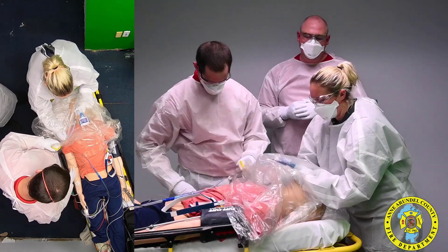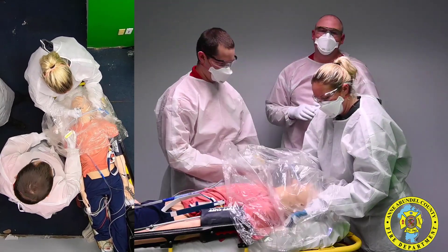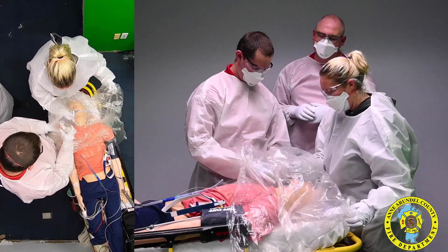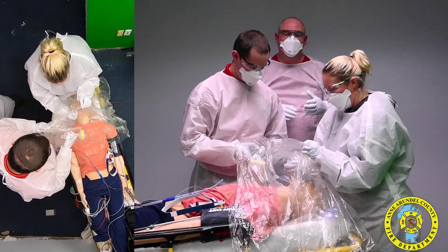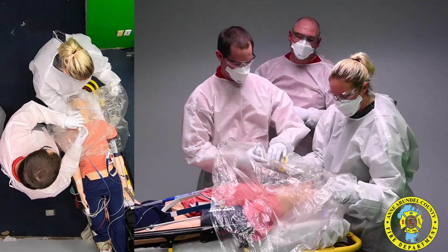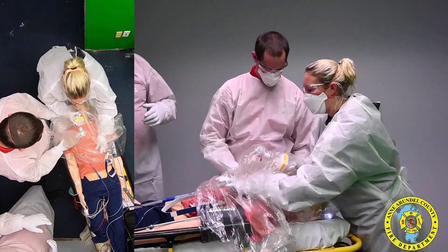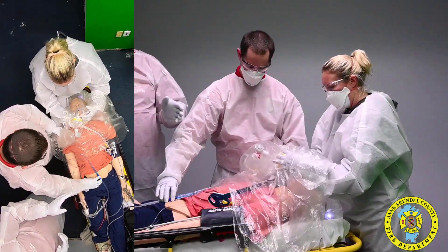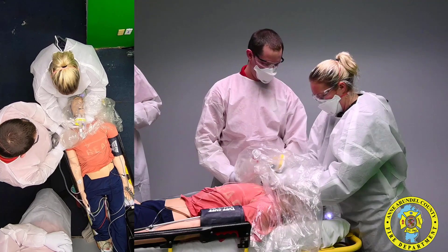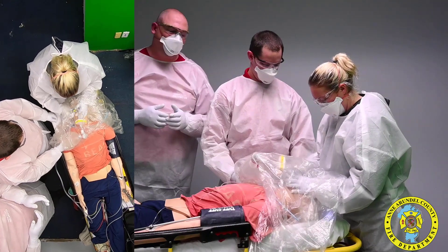Once you visualize the tube passing, she is going to remove the stylet. Our second clinician is preparing the HEPA filter and the capnography device. The HEPA filter and capnography, along with the bag valve mask, are going to be connected to the ET tube, maintaining that protective layer for droplet protection. We are going to confirm ET placement by listening for lung sounds, looking at capnography, and feeling for compliance. Once the ET tube is confirmed, we put the tube holder in place.